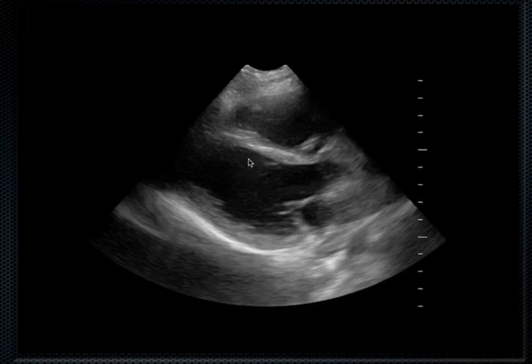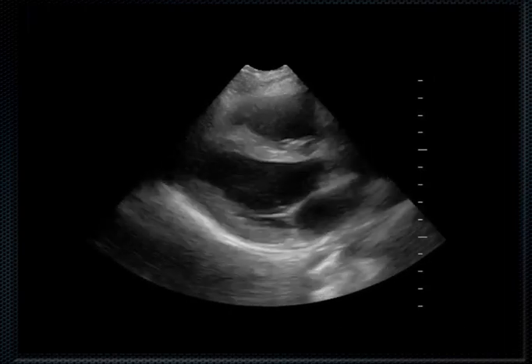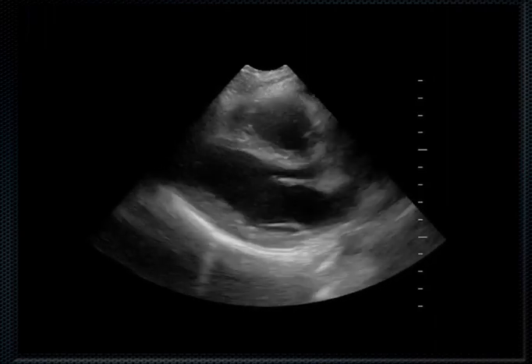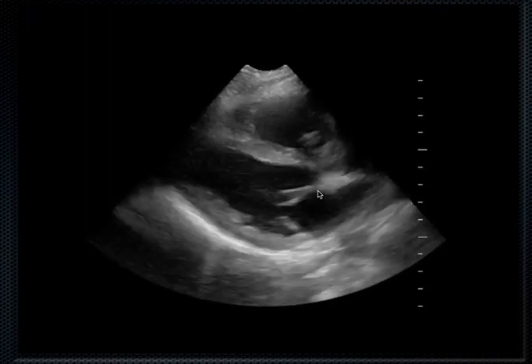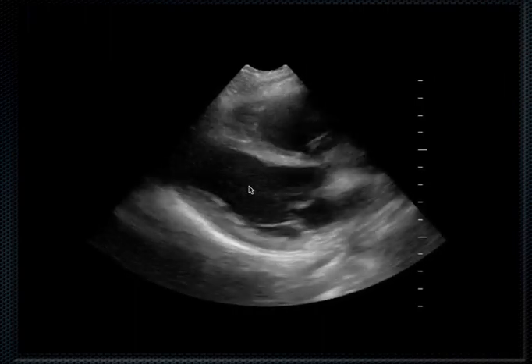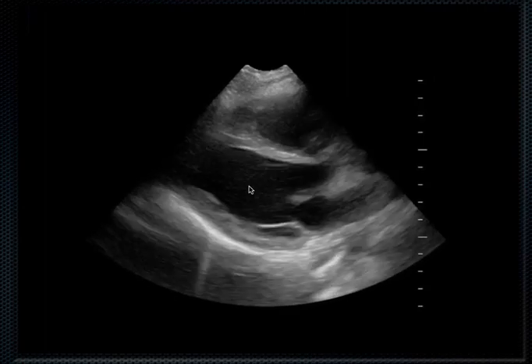And so what you kind of want to look at is the comparison of those two volumetric measurements. Now you can do a lot of fancy calculations here, but a lot of studies have showed that a qualitative look at the heart by looking at the septal leaflet and by looking at this squeeze here is enough to judge whether the left ventricle is functioning well or not.